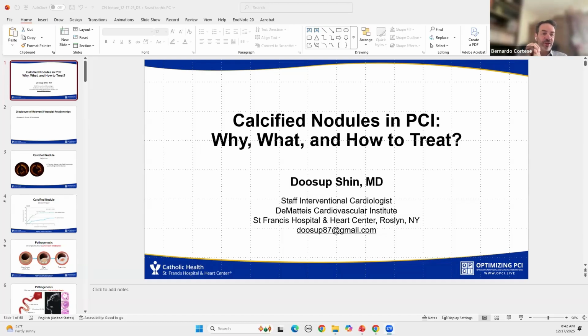But I had a question related to a case that we are publishing. It's an interesting case on the evolution of this disease, because when you see a calcified nodule in a cath lab, you have to deal with it as you see it now. But as with any other thing in the body, it changes with time. This is a lady who had a non-eruptive calcified nodule diagnosed, and after a few years she came back with this calcified nodule becoming eruptive. We have OCT images, from non-eruptive, stable, to eruptive.